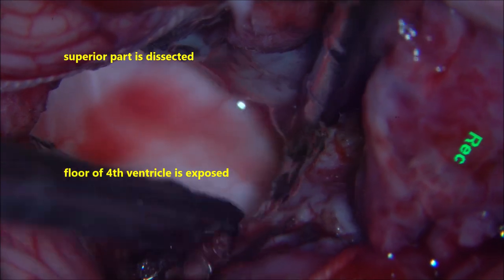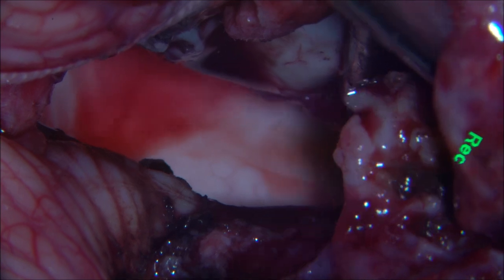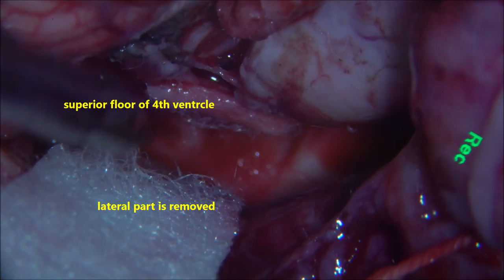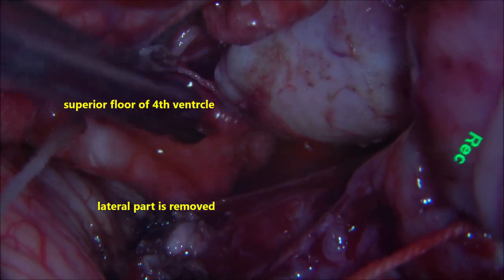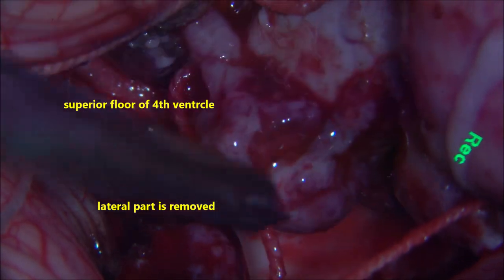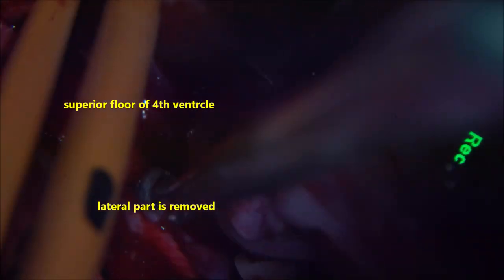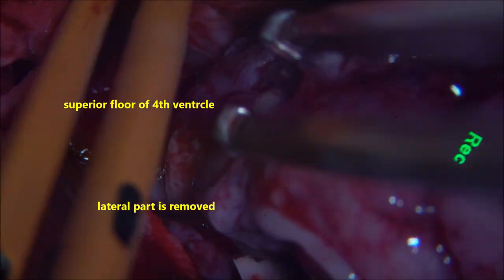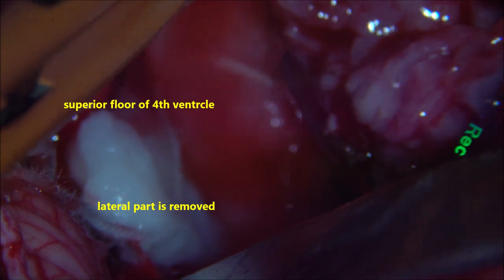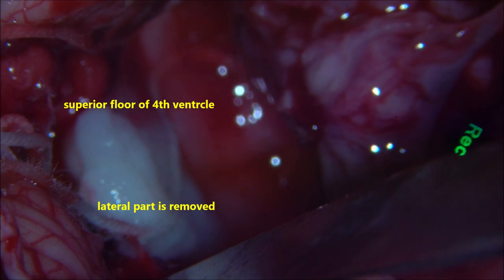Once the superior part of the tumour is taken out, you can see the floor of the fourth ventricle. The superior part of the floor of the fourth ventricle comes into view, and the lateral part of the tumour is getting easily separated. At this juncture, we prefer to close the aqueduct of Sylvius with cotton so that blood from the dissection site of the tumour bed doesn't escape into the aqueduct and go into the third ventricle, potentially forming a hematoma or blocking the aqueduct and leading to hydrocephalus.